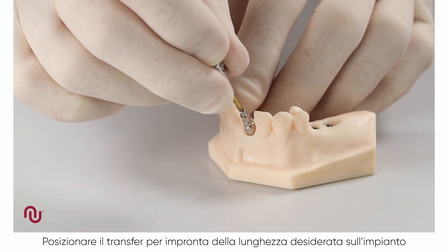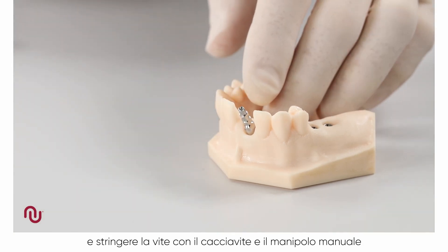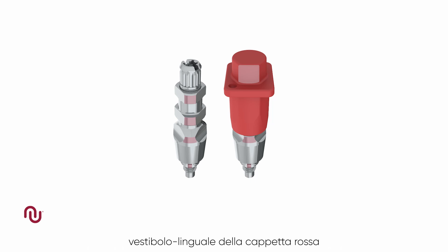Place the desired length impression coping onto the implant and tighten the screw with the screwdriver and manual handle. The upper part of the impression coping has a direction indicator located between the two flat surfaces that will enable the red cap to orientate buccolingually.